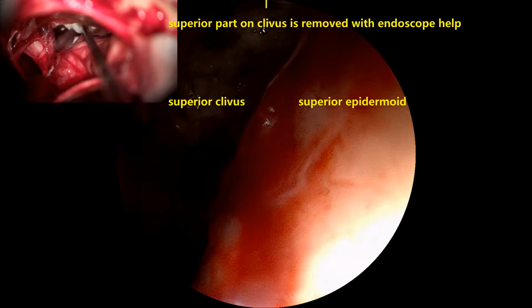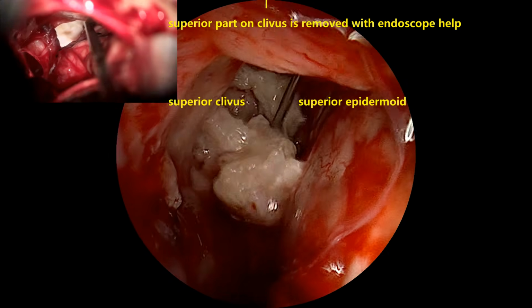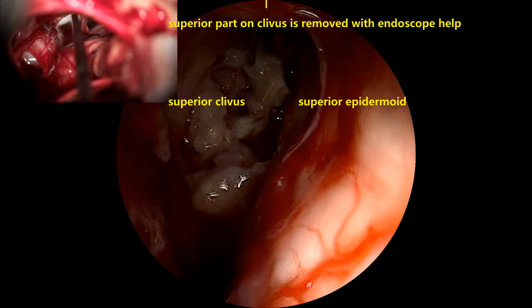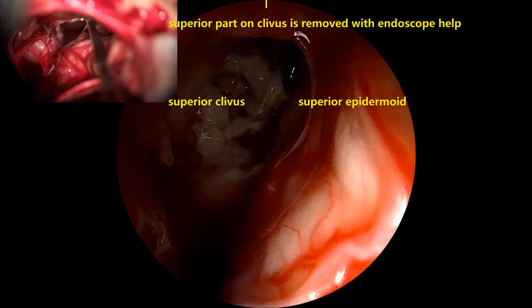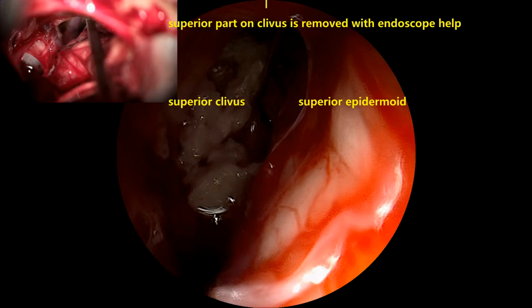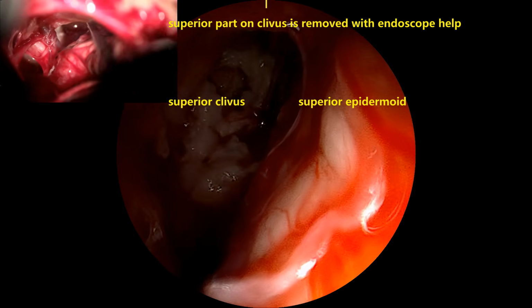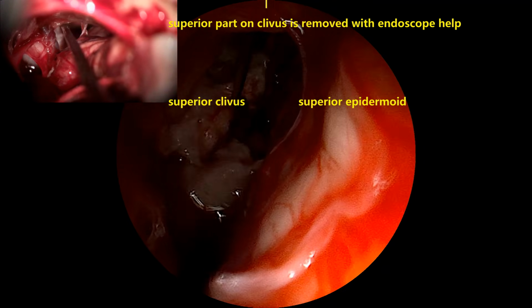Anterior to the midbrain at the level of posterior clinoids, it is gently separated and brought down superior to the trigeminal nerve. This is dissected and brought down into the lower space, and we can excise it, or extract it or remove it in the lower space. Slow, meticulous, gentle dissection is of utmost importance rather than hurrying up to take out this lesion.